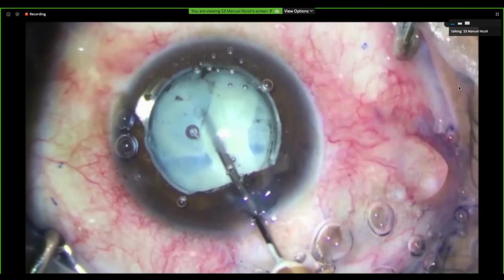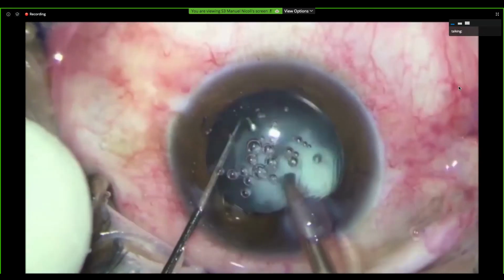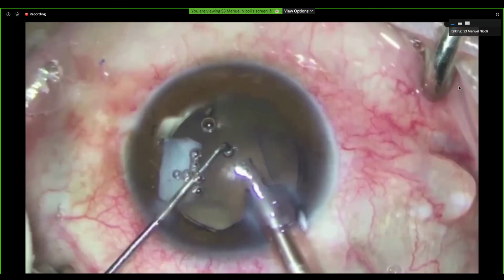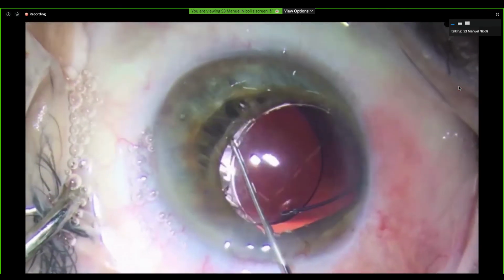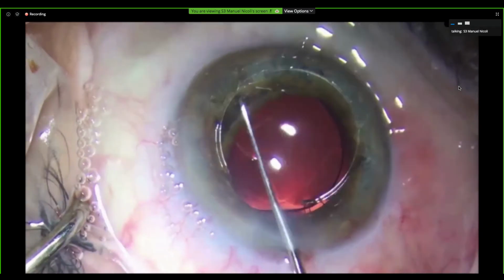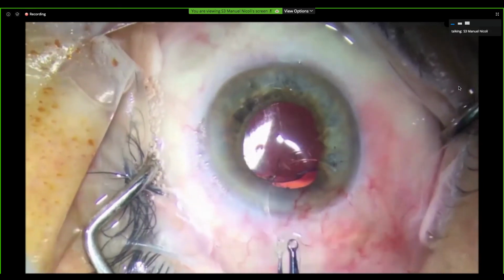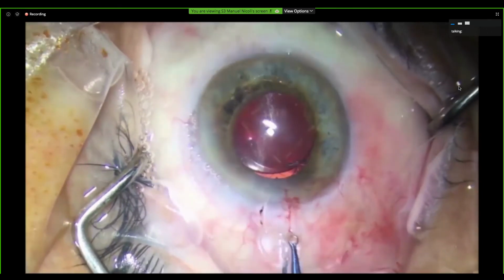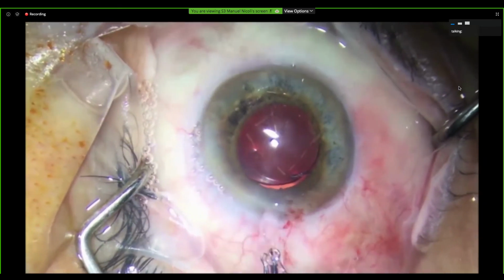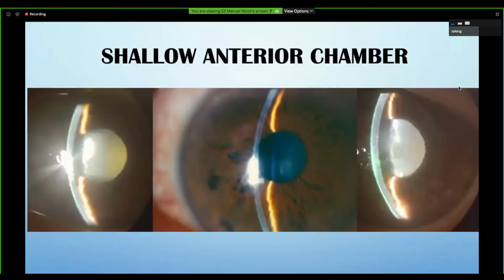And here we see an Argentinian flag case with a ring on, and you see the stability of the ring at the end of the case. This is how we disengage the ring, and we move it forward to the anterior chamber, and then we pull it out with the McPherson.